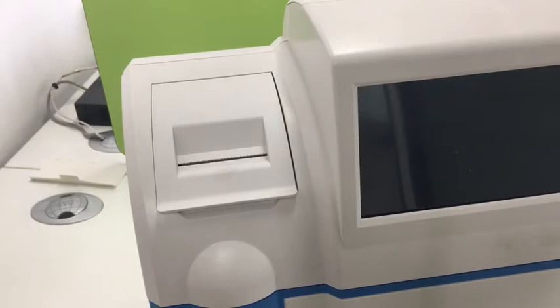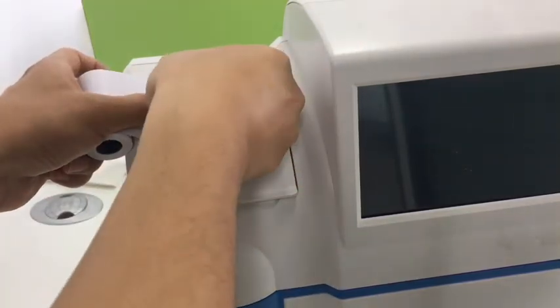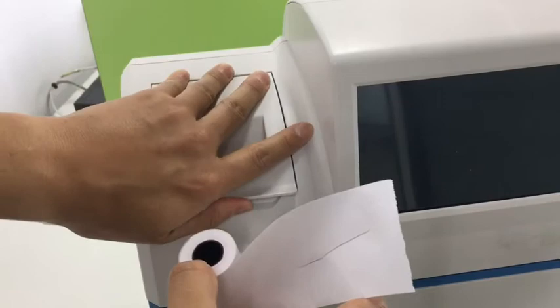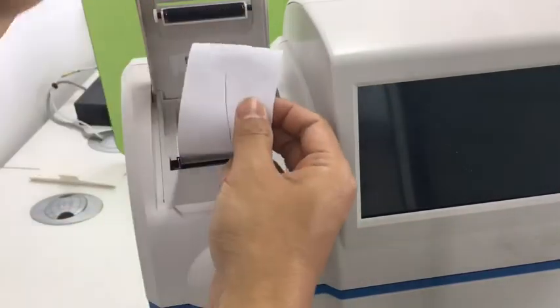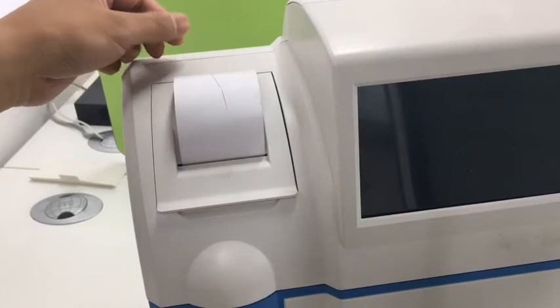Now install the printer paper. We hold the paper like this and pull a piece out. Then we use our fingernail to scratch it. If there is a black line, it is the thermal side. Then we open the printer door, put it inside, let the paper go through the hole, and close it.